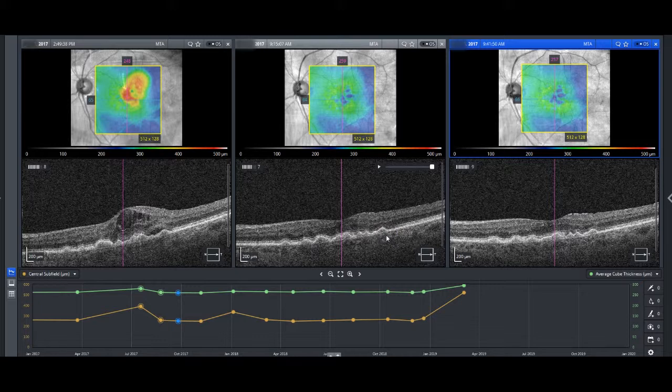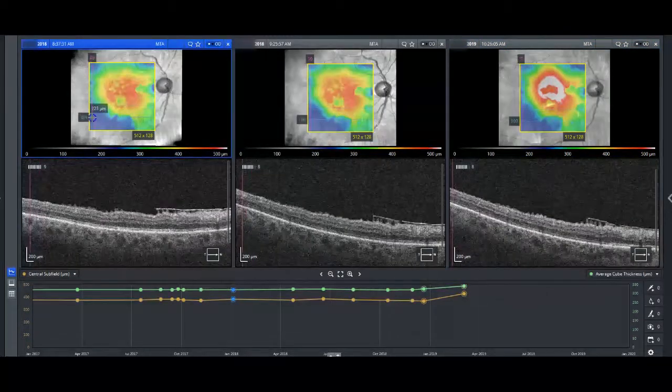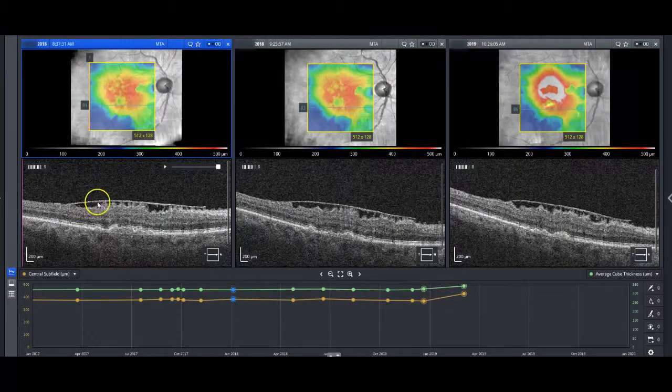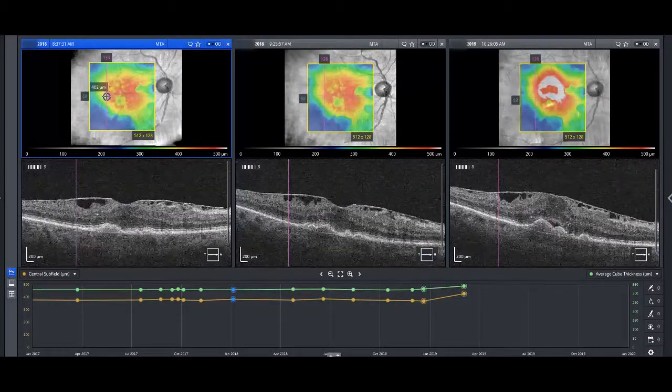So that's pretty standard. There's a lot we could talk about there, but I think the other eye is a bit more interesting. When I flip over to the right eye, what you'll notice is that this patient has an epiretinal membrane. If we just concentrate back in January of 2018, and I scroll through the images, you'll see that there's an overlying epiretinal membrane. There's a lot of retinal thickening. You can still see your drusen down below. But what you don't see is a substantial amount of intraretinal fluid.